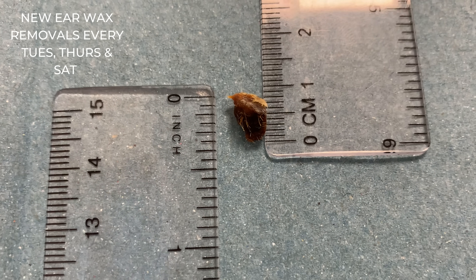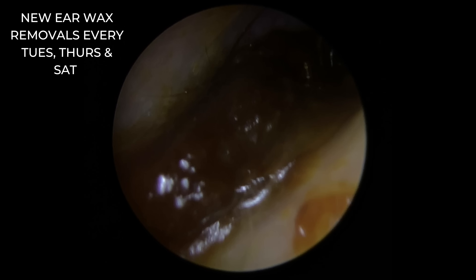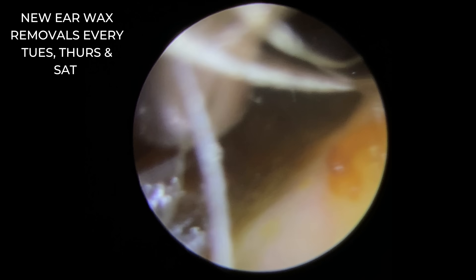Wax that's darker tends to oxidise a little bit more, so it tends to be a little bit harder. Now this is the second patient in the compilation — talking about darker wax. Look at the colour of this. A very, very dark colour wax.